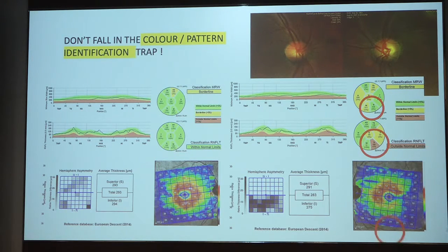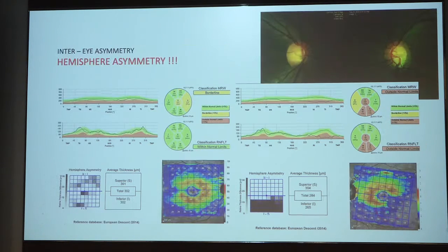1, 2, and 3. So on my OPD paper, if you see some patient comes to you, you will see 1, 2, 3 plus. That is this. Very, very simple thing. That means you have done the due diligence of looking at all the 3 structures at one time, and you have done the structure-structure correlation. Now, how is inter-eye asymmetry important?